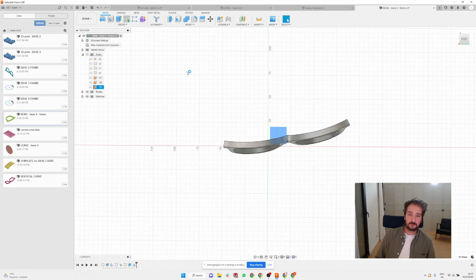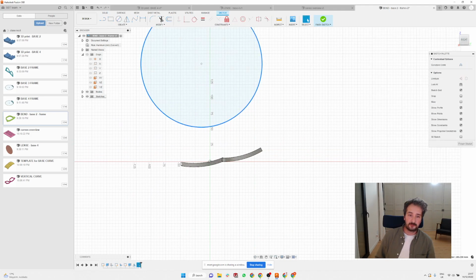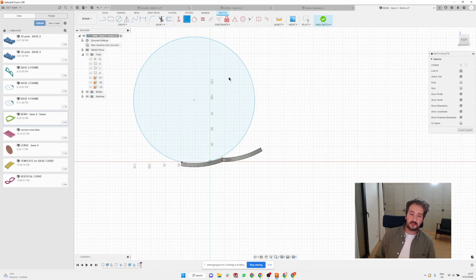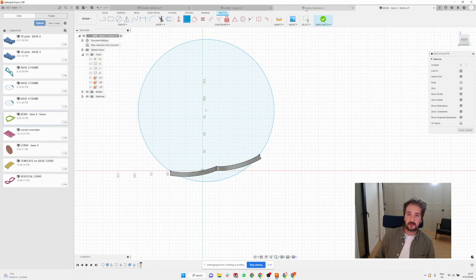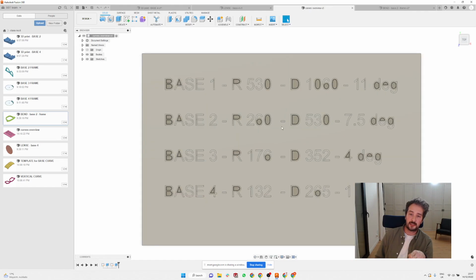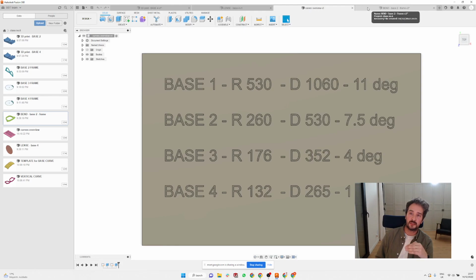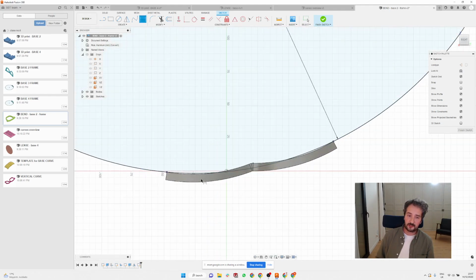And if you want to check what the radius is overall, we can again create a sketch on this plane, and I'm going to create a little circle which can show us where we are. I press this and this and put the coincident constraint here and here too with this little point. If I want a base 2 curve for the whole frame, the diameter of the circle needs to be 530, and it's supposed to match this curve. So I'm going to create a dimension and put 530, and you can see it's not perfectly matching the frame, but it's very close.